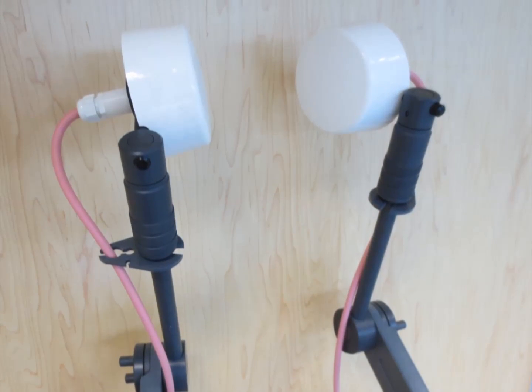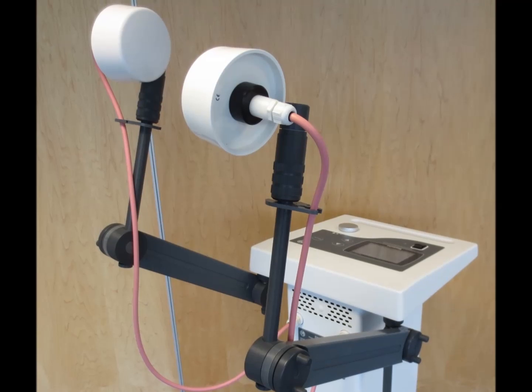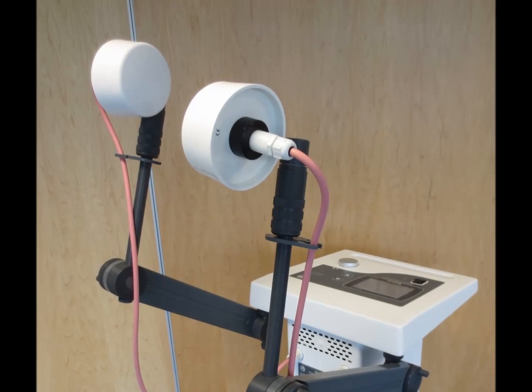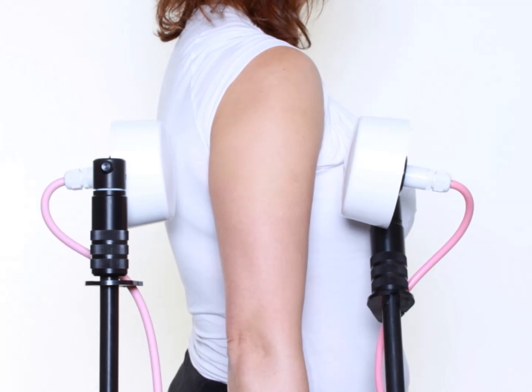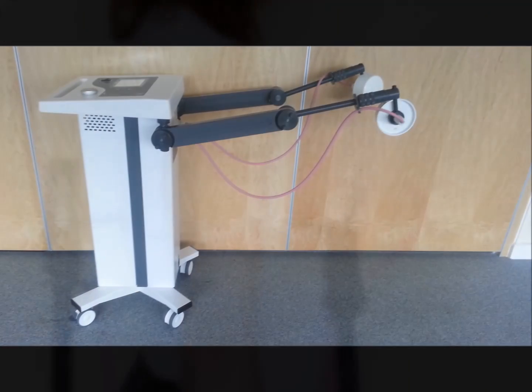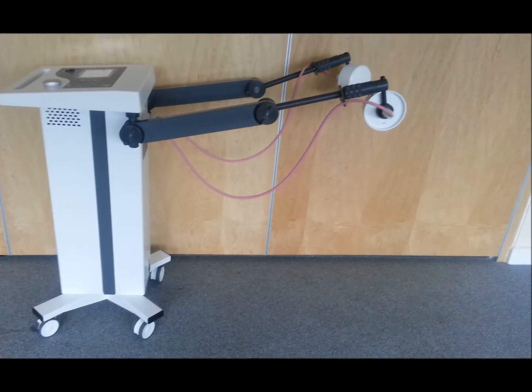The electrode arms are most important in any shortwave therapy device. If they are not robust and stable, this will cause the electrode position to become compromised and will result in a different area of the patient being treated during the session as the arm slowly falls. The EMS Physio electrode arms are completely stable and remain in position for up to 30 minutes, even using the heaviest electrode.